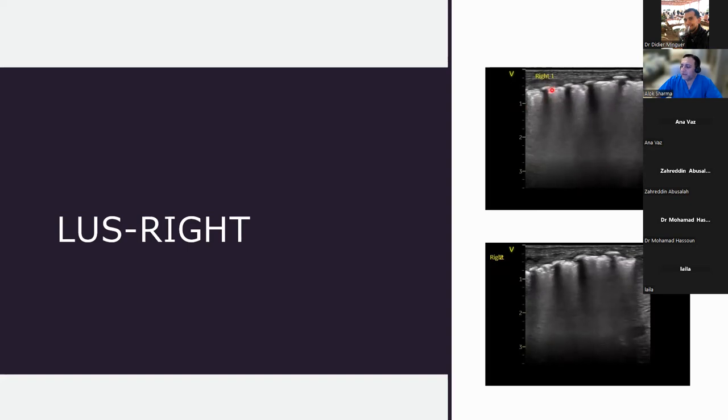The question from my perspective is just this area here, whether it stretches quite deep and whether you have a slightly deeper consolidation here. Now, again, just remember for deeper consolidation, I'm clarifying again, you must have an irregularity that stems from the pleural margin. So if you saw something over here that looked like a consolidation, but your pleura was completely regular, then by definition, that's not a consolidation.